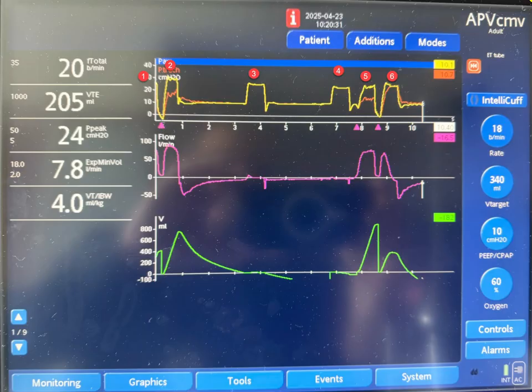the ventilator is triggered. So now the ventilator is triggered. The pressure delivered should be less than the pressure that was used in the previous breath, because we have a larger tidal volume than the targeted tidal volume of 340. I don't think it was lower here, but let's just go forward. So this breath resulted in inspiratory flow, and of course the patient is still breathing. He ended up getting 800 ml of tidal volume.